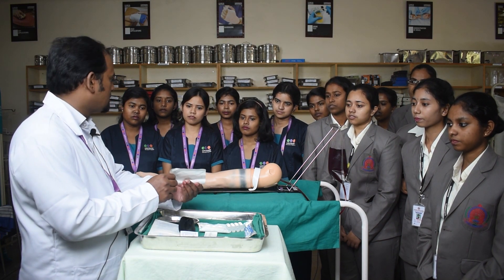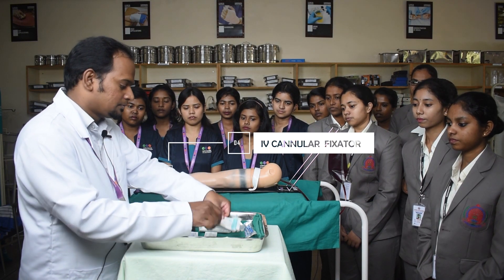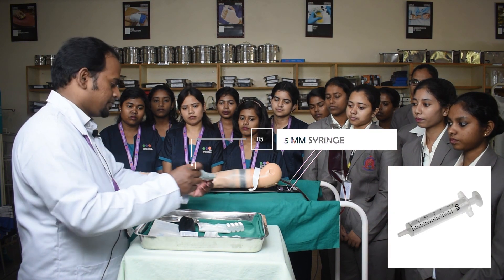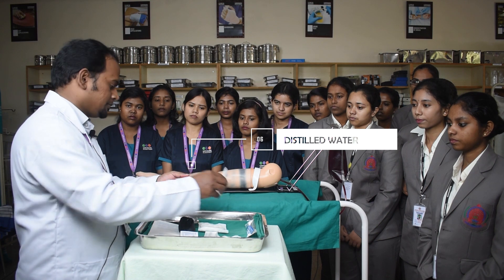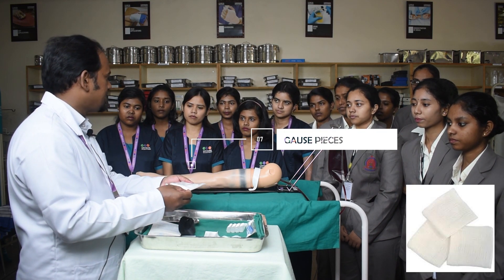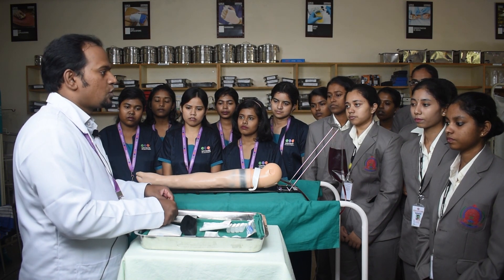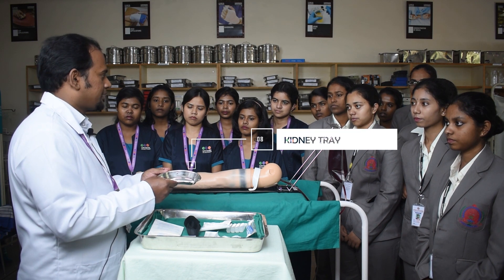To fix the IV cannula, we have an IV cannula fixator. Next, we have a 5ml syringe along with distilled water, and a pack of gauze pieces to clean any blood spillage. To discard the soiled gauze pieces, we have a kidney tray.